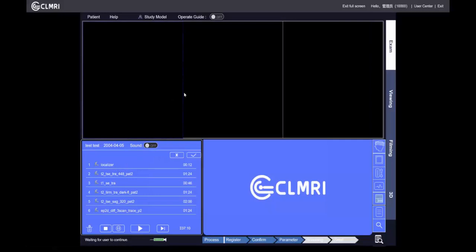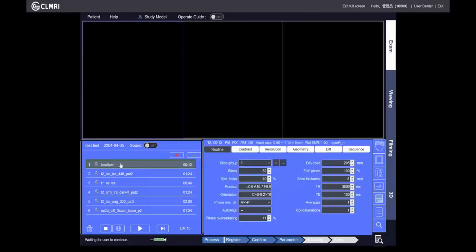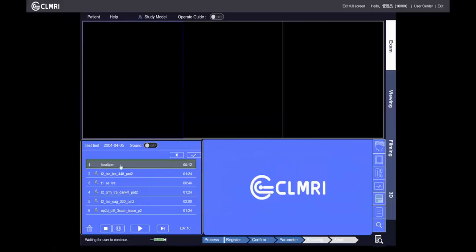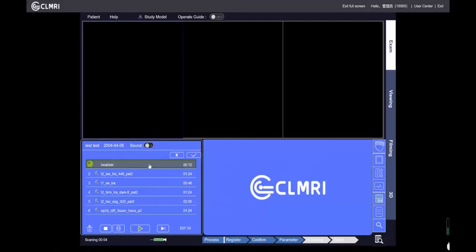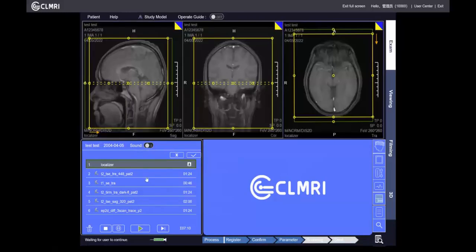Now we enter the main interface of the simulator. Click the first sequence — the localizer — then click the tick button to make sure the sequence is ready. Click the scan button to start the localizer. The localizer sequence is finished.